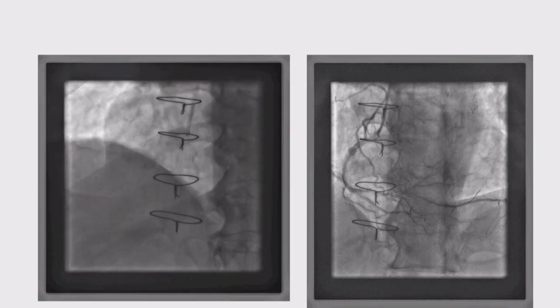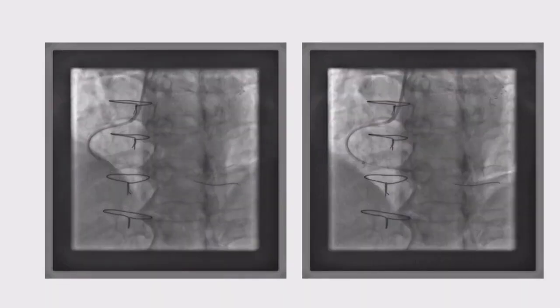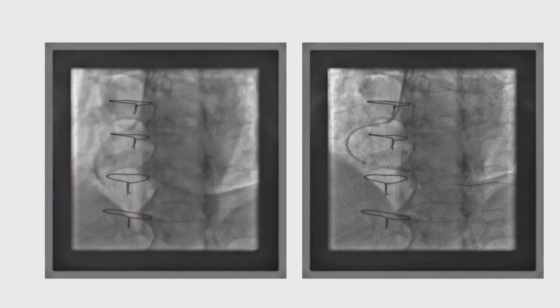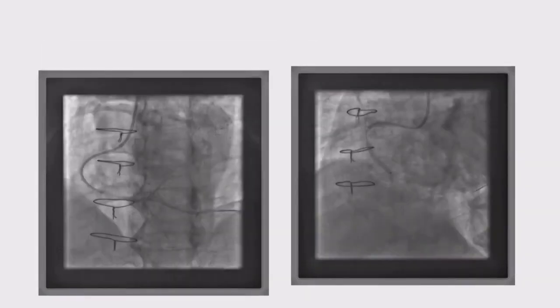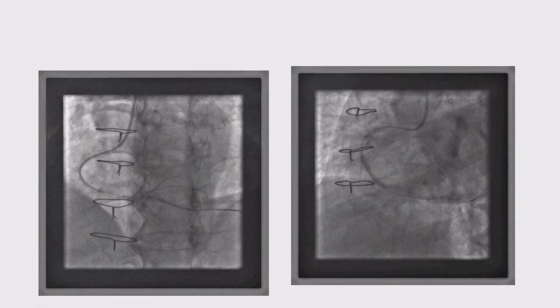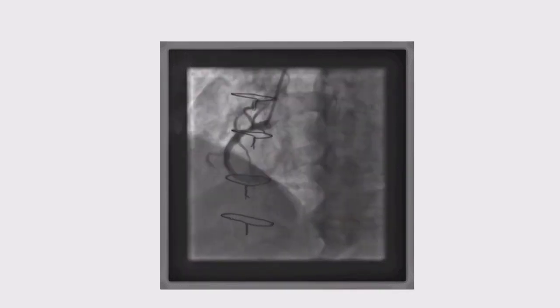We wired it, but failed to take the balloon even without support. So we had to take a microcatheter in. And you can see it's quite deep set, not a microcatheter, sorry, the extension catheter inside the RCA. Only then could we put the balloon there and dilate the vessel with the NC balloon. And then of course we also put the stent with the support of the extension catheter. It was GuideZilla, of course, and another stent in the mid-segment. And that was the final result.